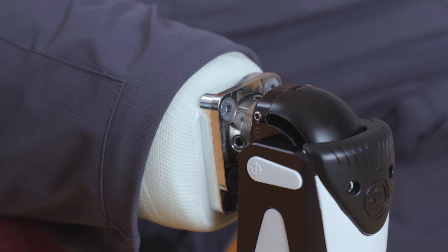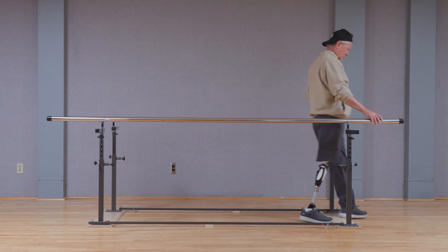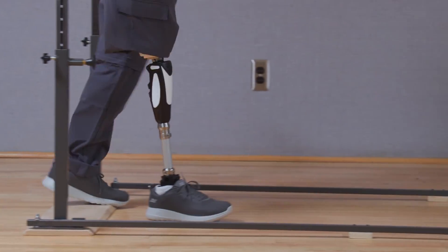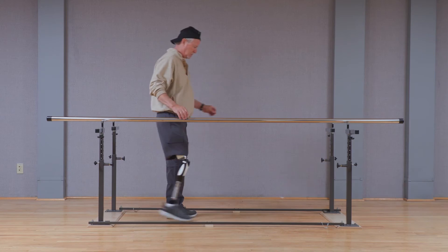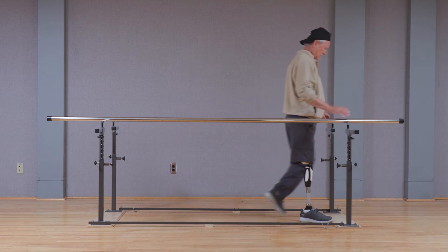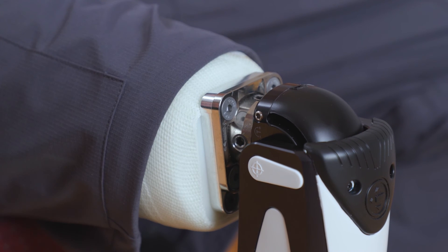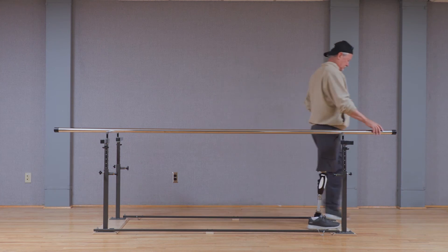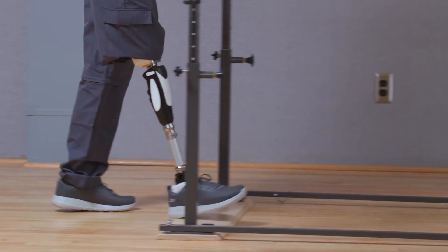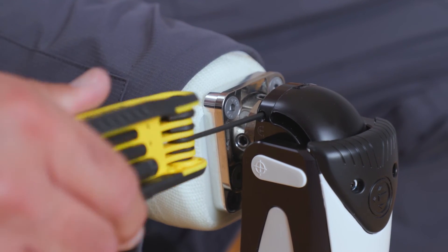Adjusting the stance trigger resistance T: if the stance trigger resistance is set too high, the user may experience a hitch or catch in late stance, due to the knee not triggering into swing phase as the hydraulic flexion resistance remains high. If this happens, the stance trigger resistance needs to be lowered by turning the screw counterclockwise with a 2.5 mm hex wrench. If the knee is triggering into swing phase too quickly before the user is ready to load the contralateral limb, the stance trigger resistance may be set too low — to increase the resistance to trigger, turn the screw clockwise.